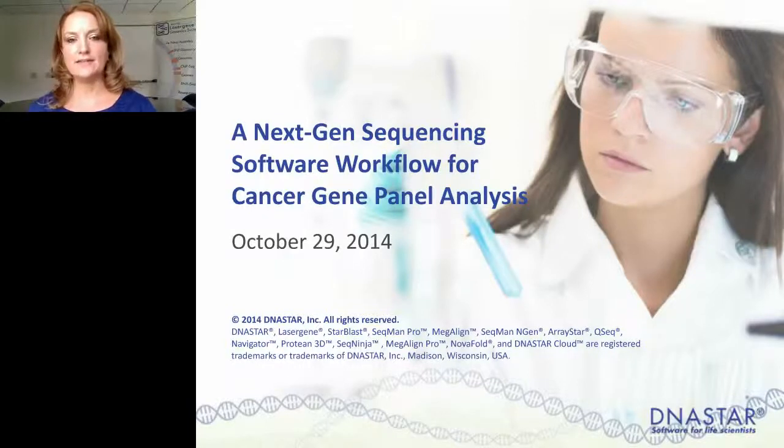I'm Kerri Phillips, and I'm a clinical product manager here at DNASTAR. And today we're going to talk about our next-gen sequencing software for cancer gene panel analysis.